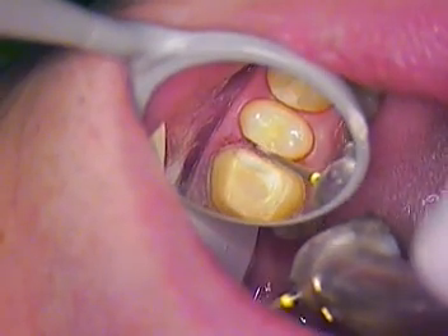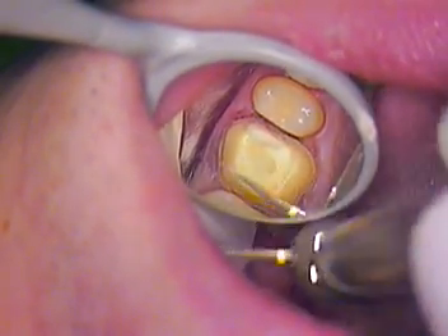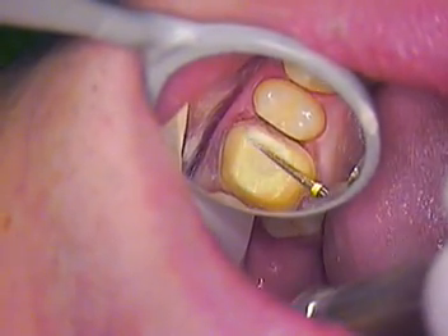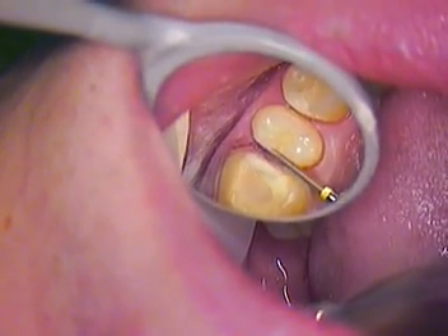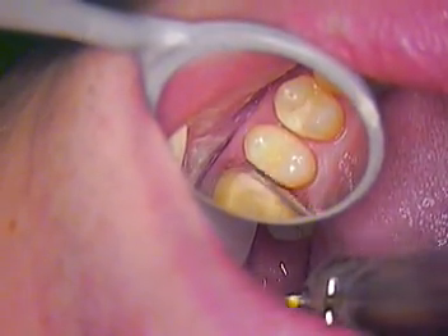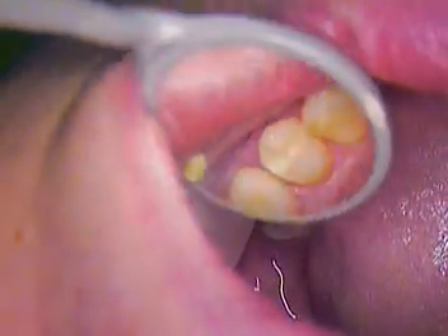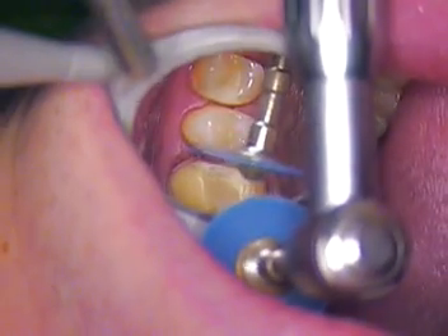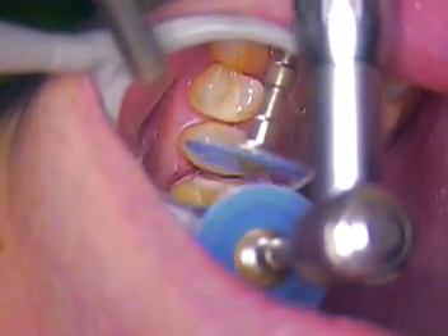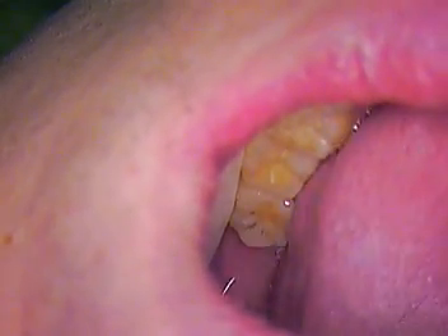That looks good. We want to make sure that this tooth, when it goes in, has a path of insertion. We should round the corners just a little bit. Orthodontically, this tooth is out of place slightly — it's a little too close to the molar, so we have to recreate some of that. Now I'll polish that again. That's a good polish. And then we'll use the cup and just round that margin, just a little bit. We'll check our occlusal clearance.